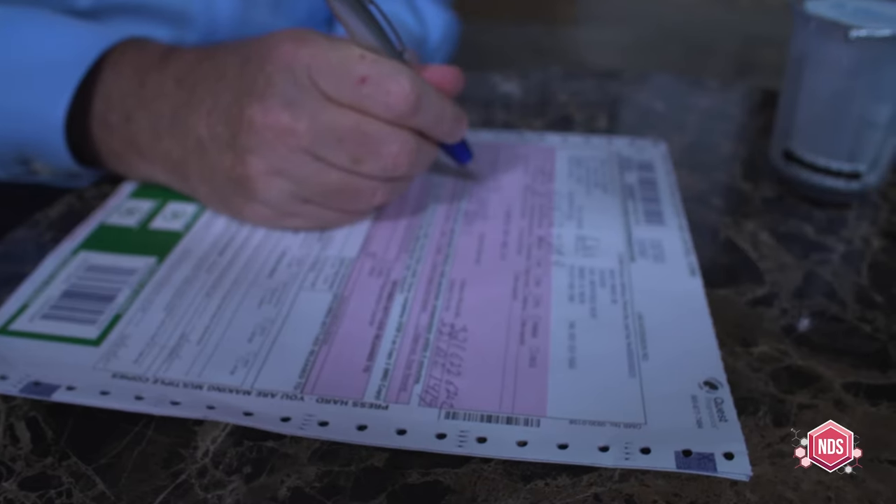I'm going to start out with the administrative section of this custody and control form. In the first section, we're going to fill in and make sure we have your right employer information. I have Bob's Trucking — is that correct? That's correct. We're going to put Bob's Trucking as the site location. There's medical review officer information on the form and you'll get a copy with their phone number. Let's start out with your social security or employee ID number — 555-12-7774. This is a DOT test for a specific DOT agency. For the trucking industry, that's normally FMCSA.